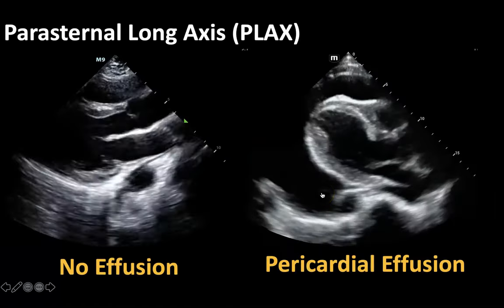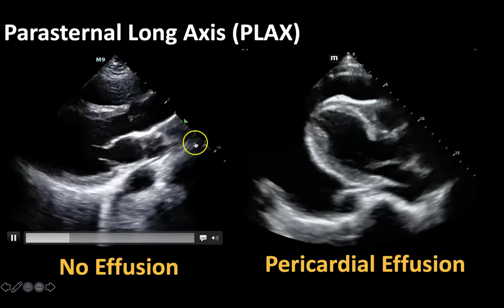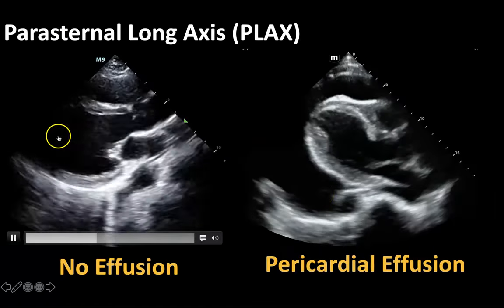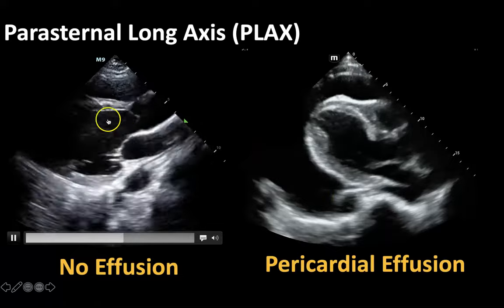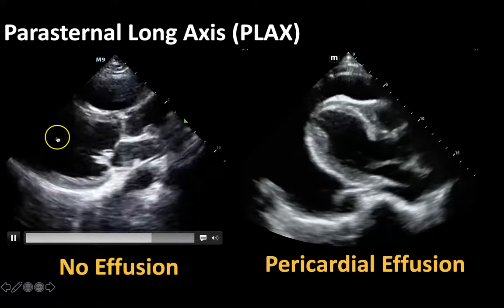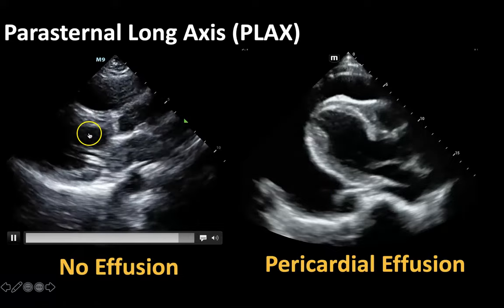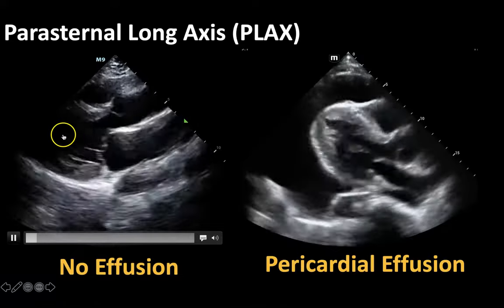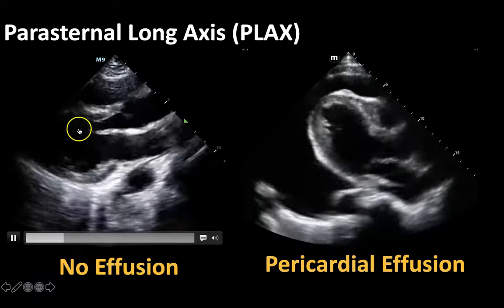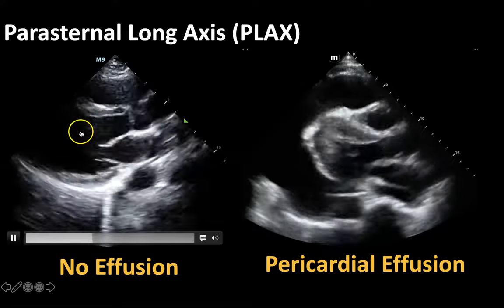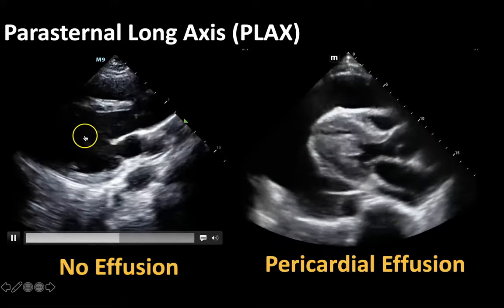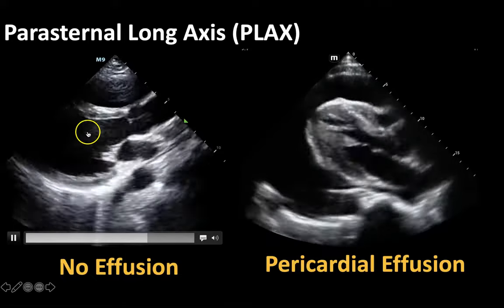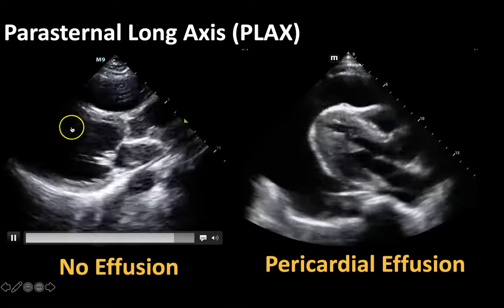So we're going to be looking for black stripes. You see here that the blood inside the heart is also fluid, which is black — anechoic, meaning no echoes — so the blood in the heart will look the same as the blood outside the heart. What we're looking for is black lines outside your heart.